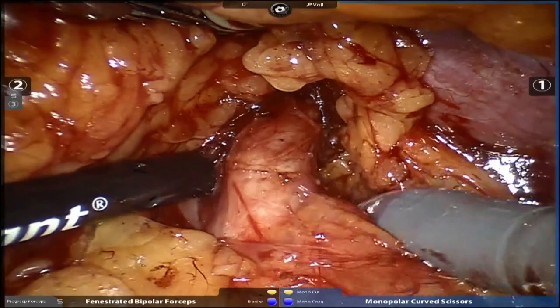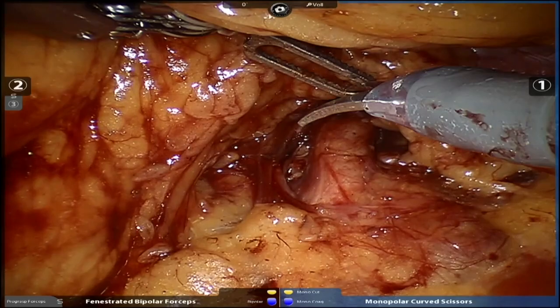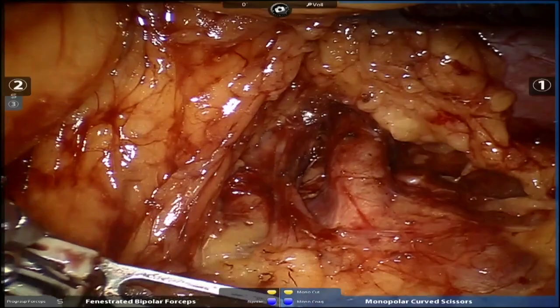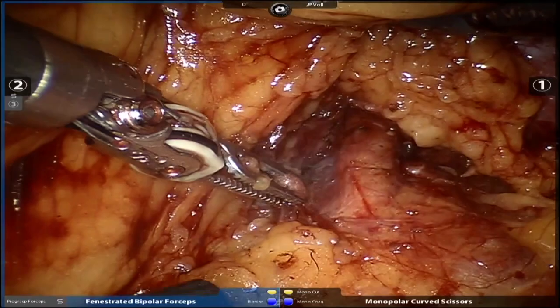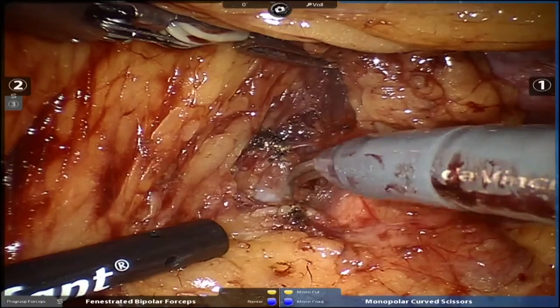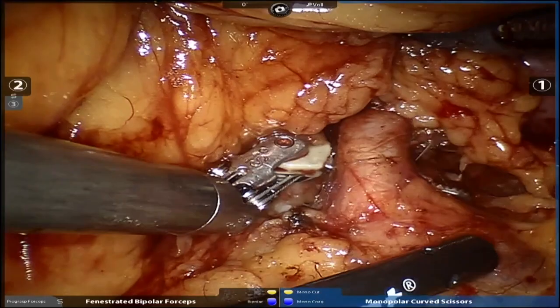Brandon, be careful about suction. Okay, we don't have air seal. Brandon, okay? There's no air seal, okay? So you can't suck as much, all right? I'm just warning my assistant, because we have standard insufflation today, he has to be very careful. There's the vein there. Suck right there. But if he sucks too much, this space is only 1.5 liters in size right now at 15 millimeters of mercury. So we have to be very careful about how much he sucks. If he sucks too much, then we're going to have a small space.